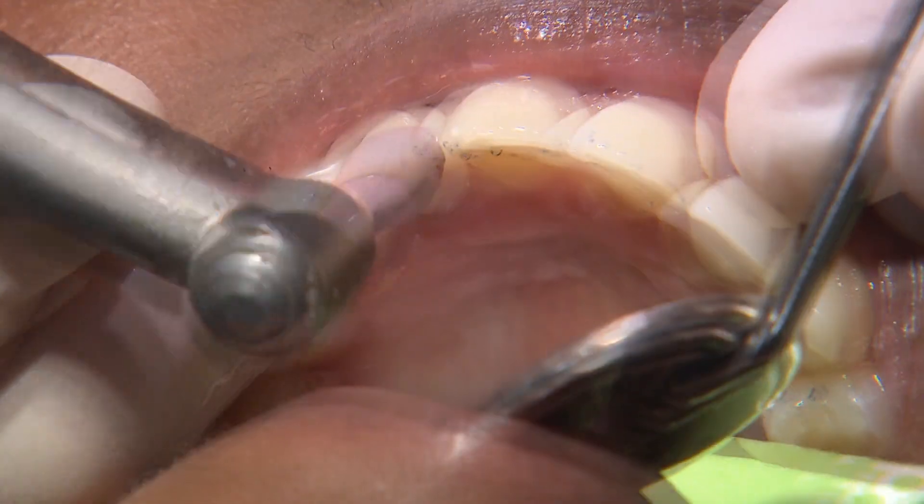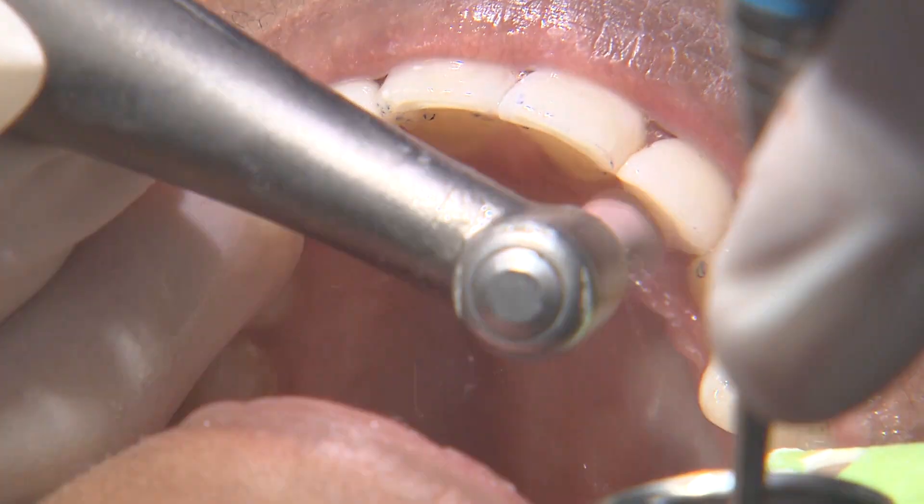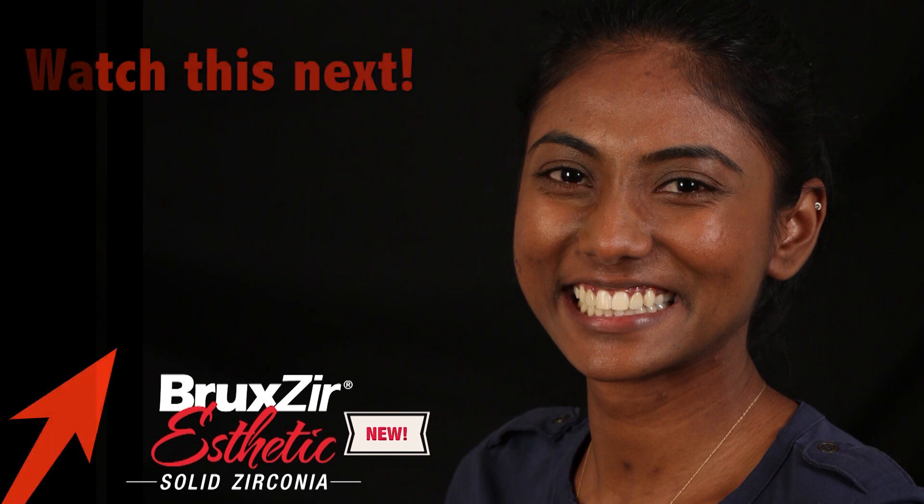That concludes the treatment process for this case. The patient was very happy with the new restorations, even commenting that the results exceeded her expectations. If you're seeking an uncompromising material for strength and translucency, Bruxer Aesthetic is just that. I look forward to sharing more transformations with this amazing material in the future.